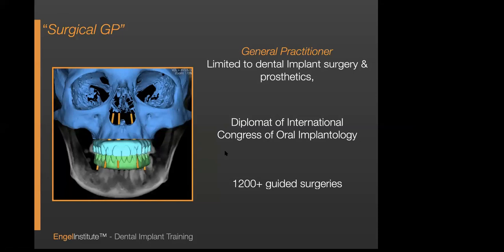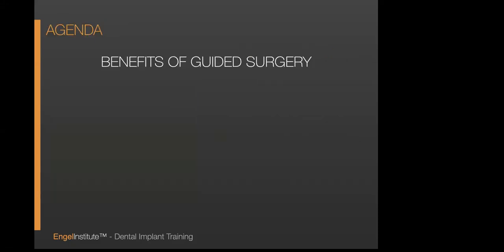I'm very tough on results, and I say that because as we get through this guided surgery lecture, it's really important that we understand that despite using a guide, or despite being a general dentist, if that's what you are, you become a surgeon as soon as you lift a drill into somebody else's mouth and place it within their jaw. You'll notice here surgical GP is blinking. And the reason that it's blinking is because the surgery is in your hands. It's up to you.